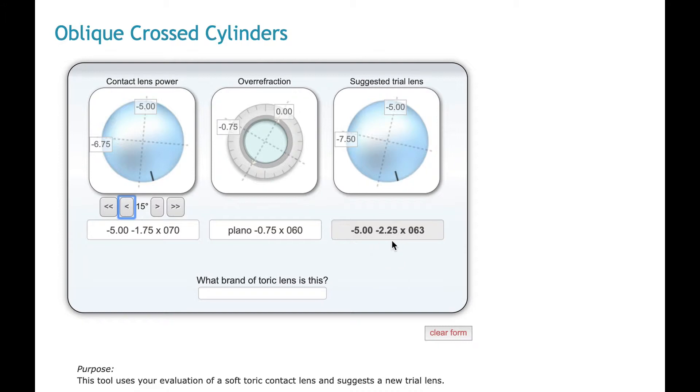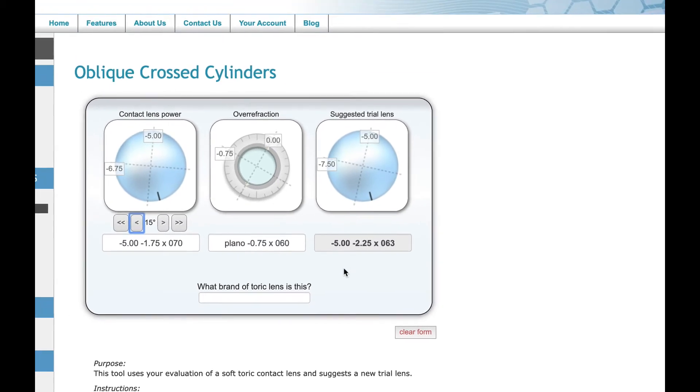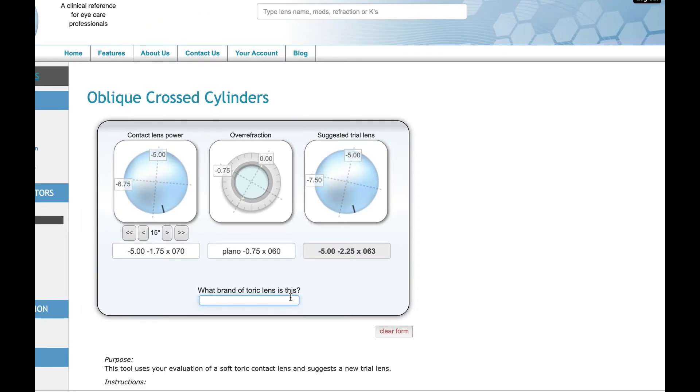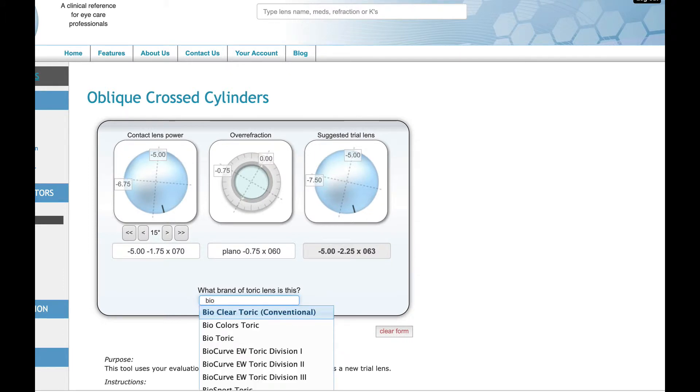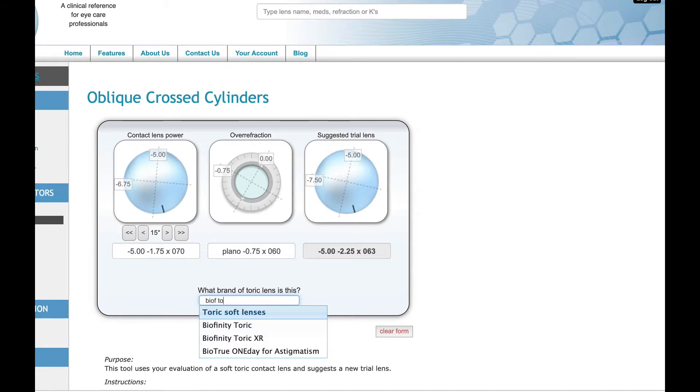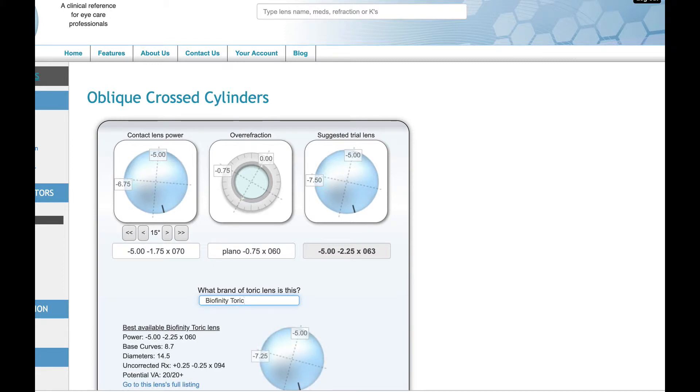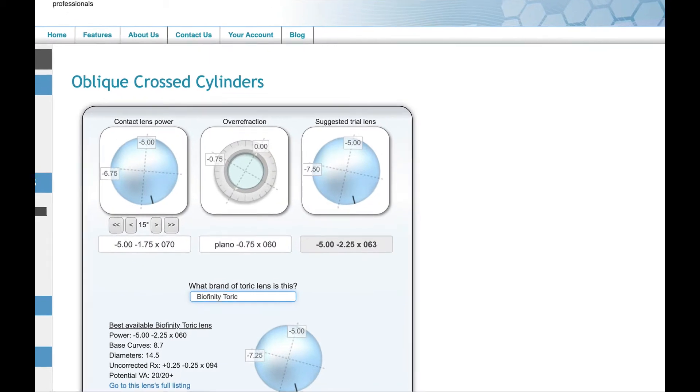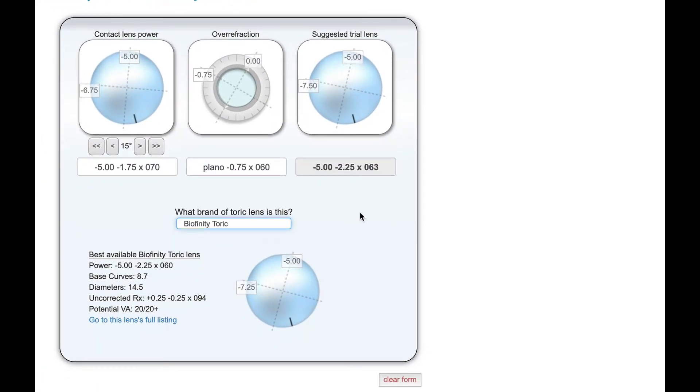We just need to add some cyl. The axis, the original lens was 70, it's saying that the best lens would be at 63 degrees. From here, we can also compare this to existing lenses. So if we tell the calculator that we're dealing with a bioaffinity toric lens, I can specify that. And it will look at that lens and see exactly what powers it comes in. And it does come in a minus 5, minus 2.25 axis 60. And because of that, we should have a lens that in theory should work well for this patient, assuming that it sits in the eye exactly like the original trial lens did.